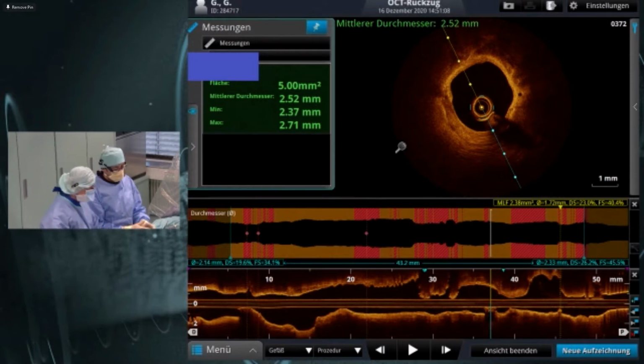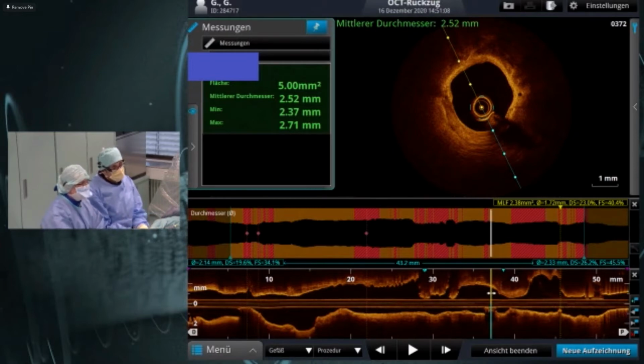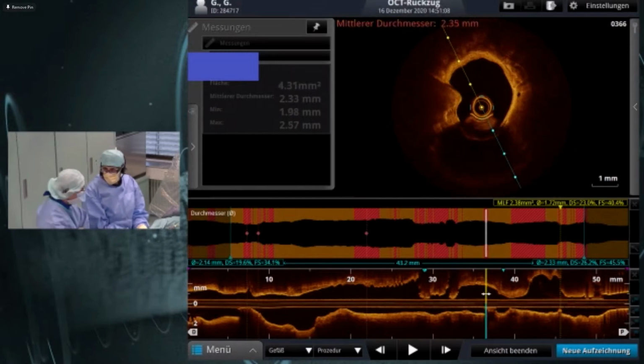And if not, this is from the OCT subgroup analysis from Carlo Di Mario as well, that in 38% he has seen a disruption of calcification at these eccentric plaques. So maybe we won't see a calcium disruption, but somehow it's modifying the plaque. So this is what we have at the moment from the data, and we'll see how the stent is possible to expand. I mean, we have no really good other options, right, Marek?